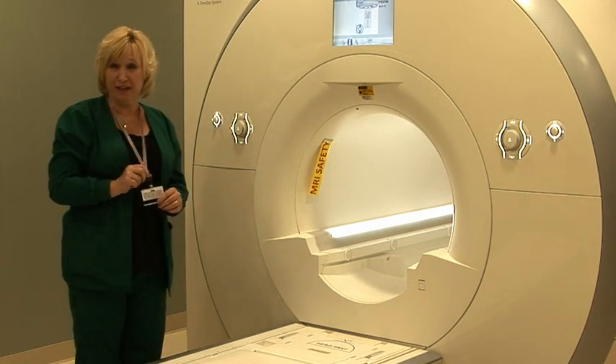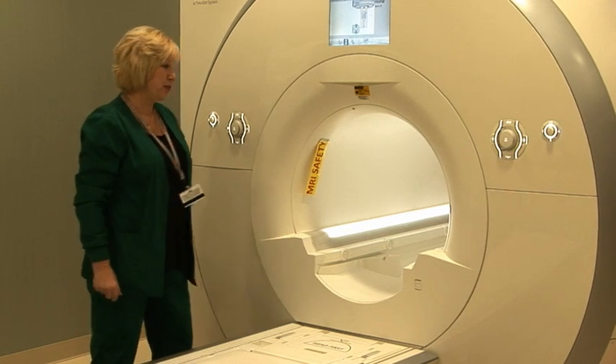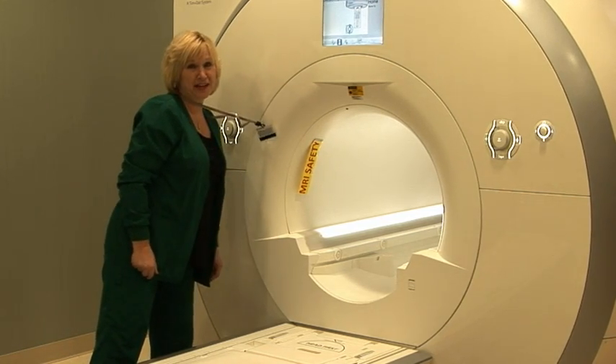Again, with our badges as well — we have to have plastic on our badges, because if we get too close, the badges will attach as well.